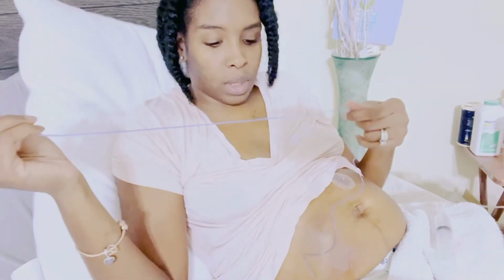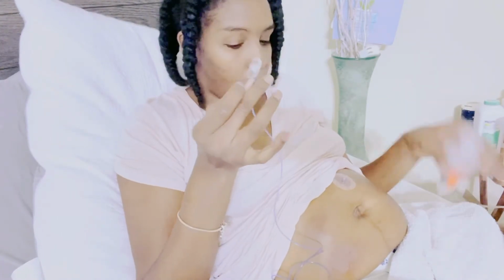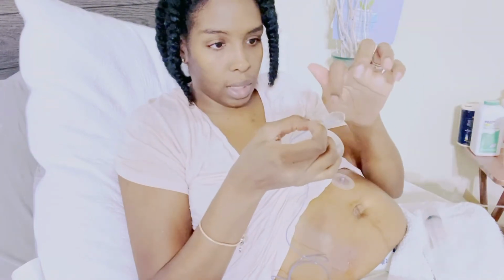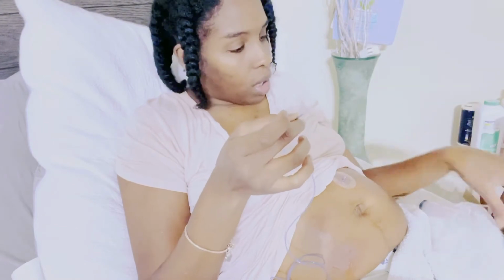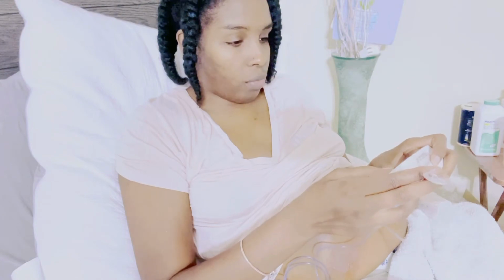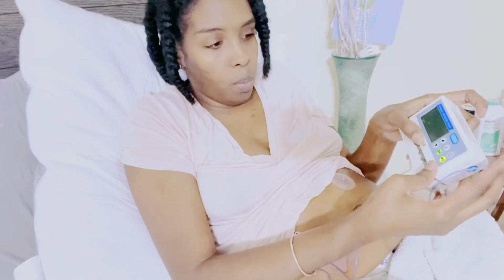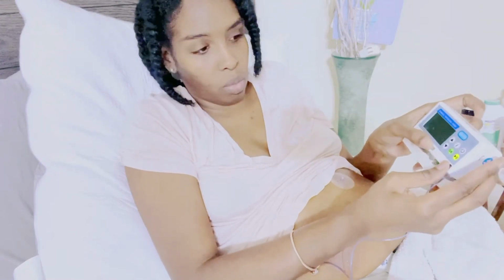But to keep air from getting into my body or whatnot, I go ahead and push a little bit of this medicine down till I see it come on top of here, because I don't want air in my stomach. So I'm going to turn this machine off for a quick second and open it by pressing this black button and the silver button to the right.